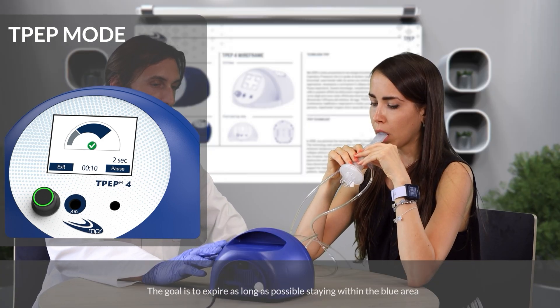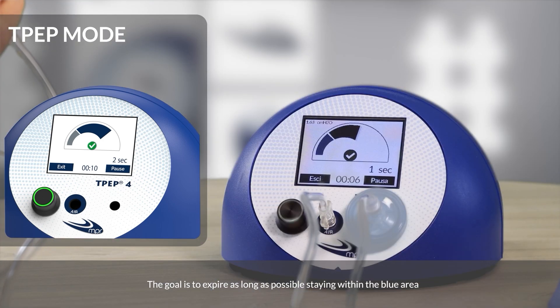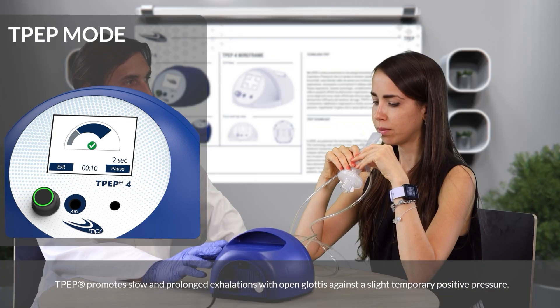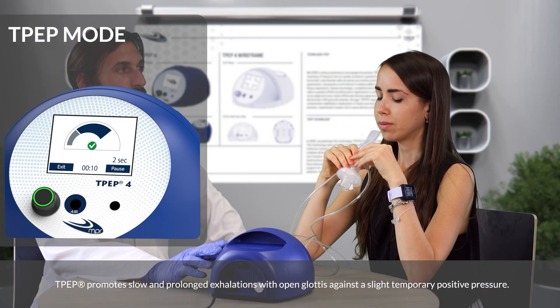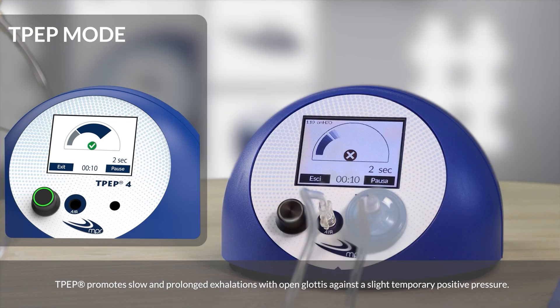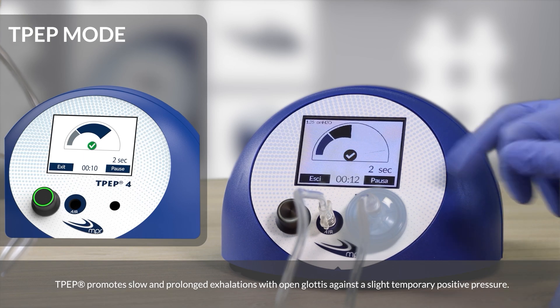The goal is to expire as long as possible, staying within the blue area. TPEP promotes slow and prolonged exhalations with an open glottis against a slight temporary positive pressure.